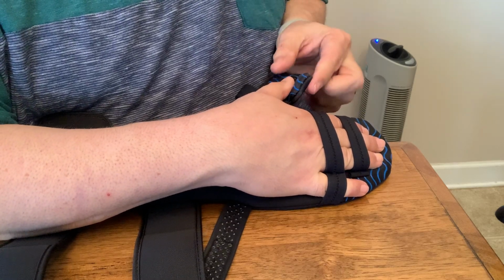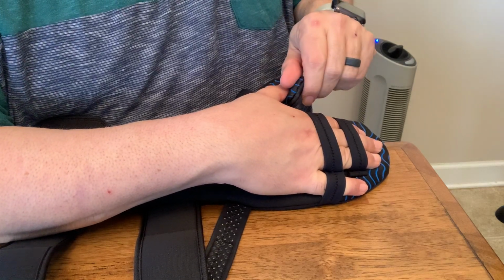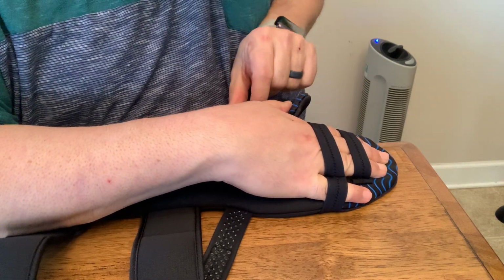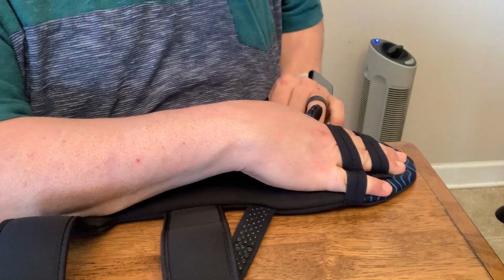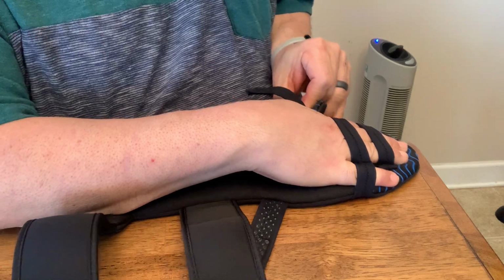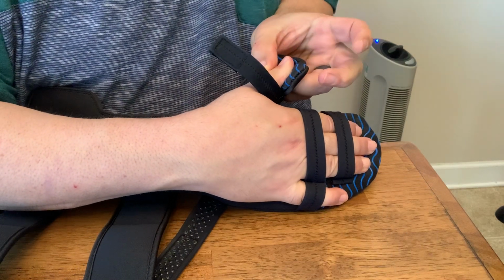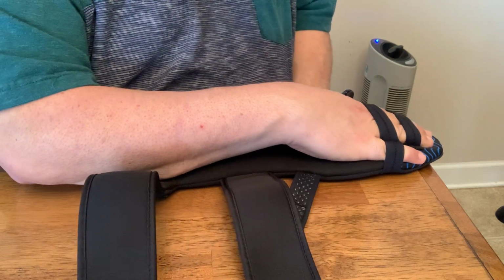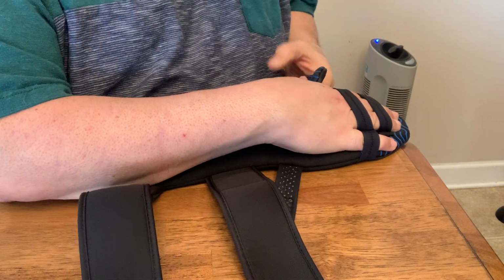Put it in, make sure this tab is upright. You've got to kind of bend it when you buy it so that it's like a little wall. It keeps your thumb where it needs to be. Oops, let me get this strap here. Get it over my thumb. Straighten your thumb, right there, straighten your thumb in that pad. And then come to the edge of the table. That's where I do all my strapping. And then Velcro under.